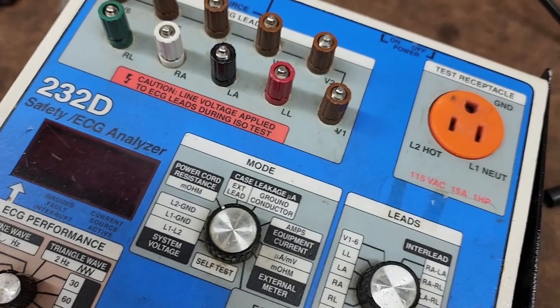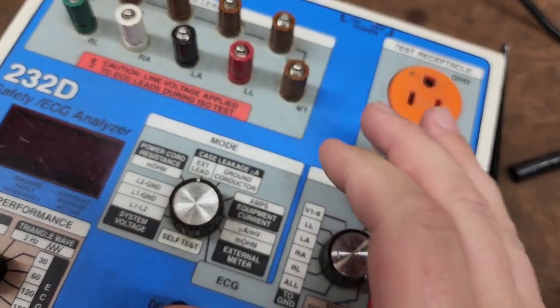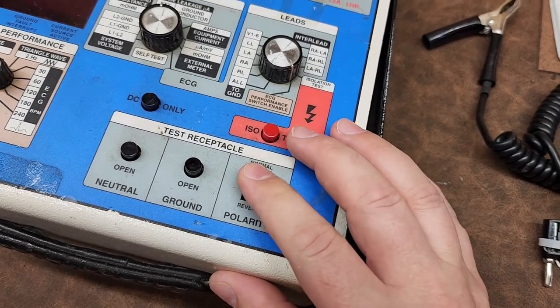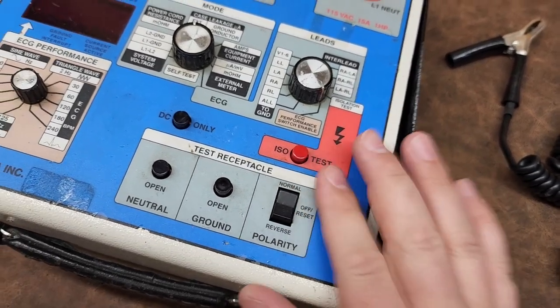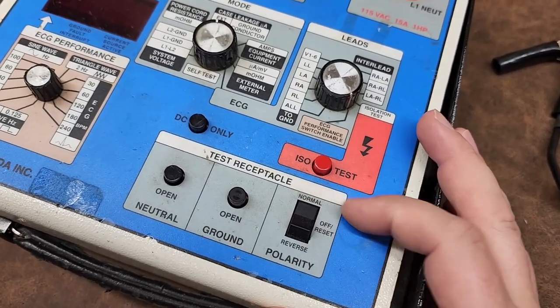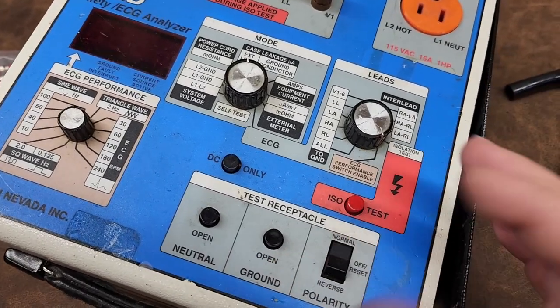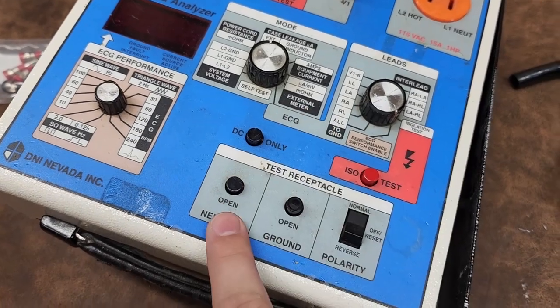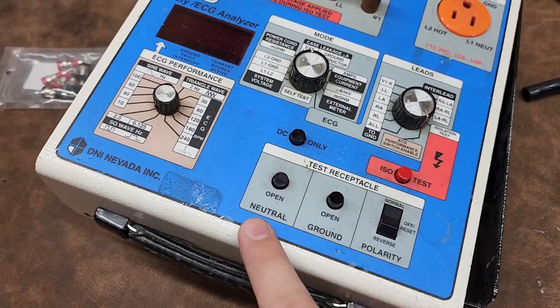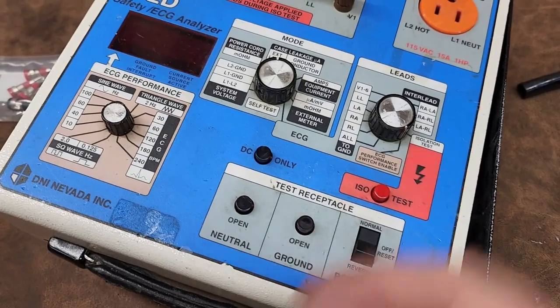One of the first things we do with an electrical safety test is the power cord resistance. Then after that we do external case leakage. We have our polarity switch, like most of these old systems do. For the most part we're going to keep it on normal — normal polarity closes your neutral and you're ready to go. Some analyzers have a rocker switch for the neutral to open or close it, but I actually dig this layout right here.